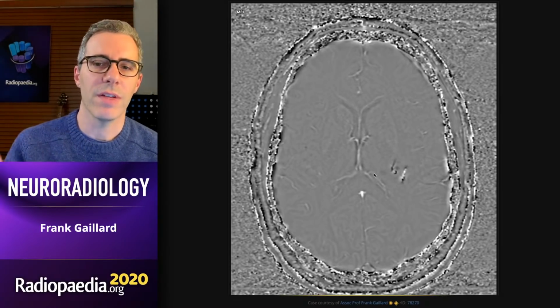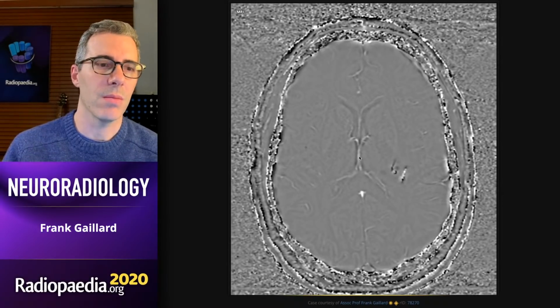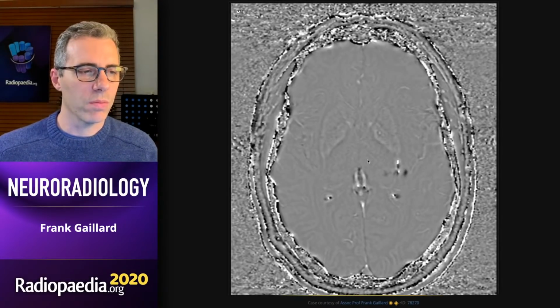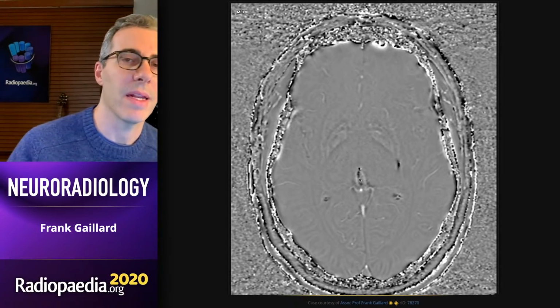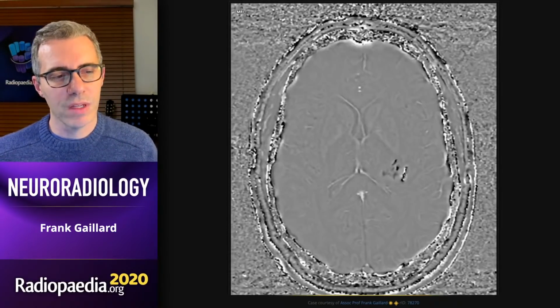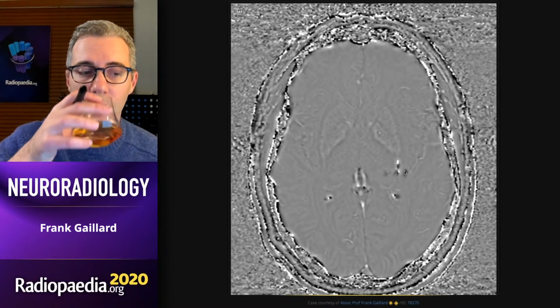Fortunately, in adults, you'll have examples of both of these. If you look at the internal cerebral veins, they're filled with deoxyhemoglobin, so that tells you that that's the paramagnetic direction. And if you look at your pineal calcification or choroid plexus calcification, you can see that calcium, being diamagnetic, is going to be black. So if we look at most of this, it's mostly black. But I hear you say, well, what about all these white bits? Well, that's the trick.